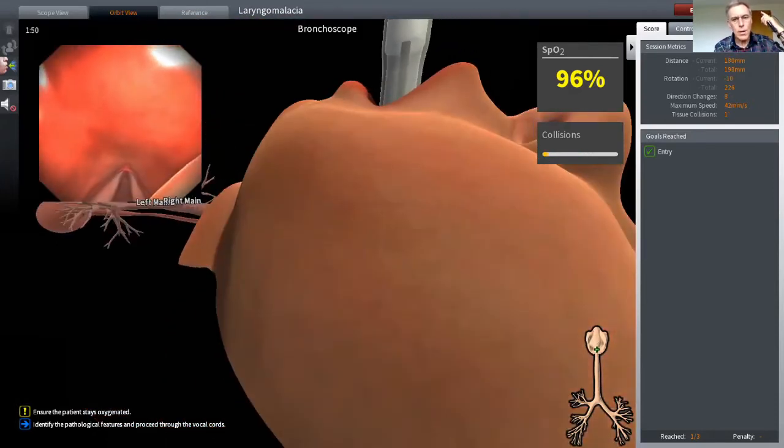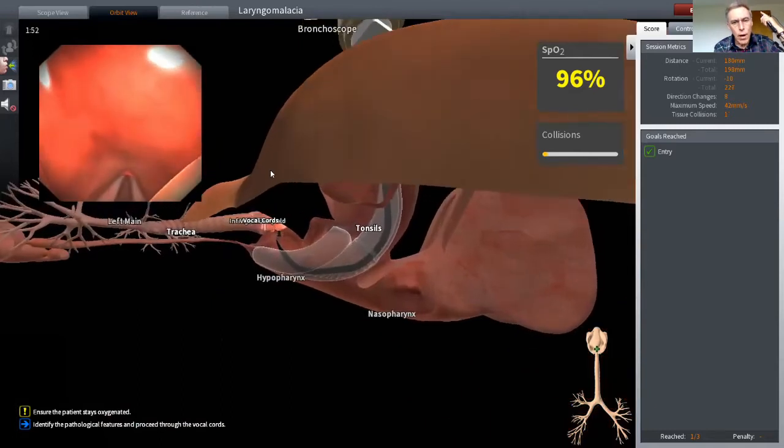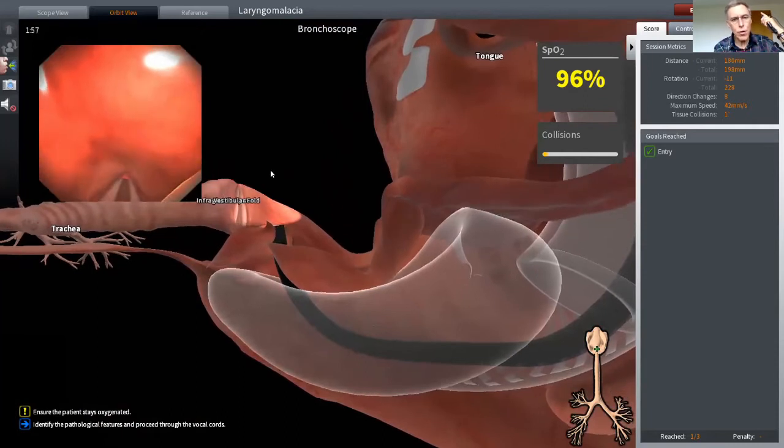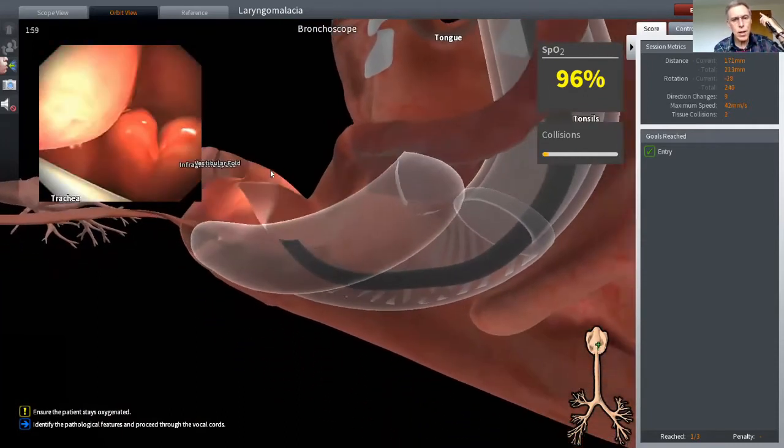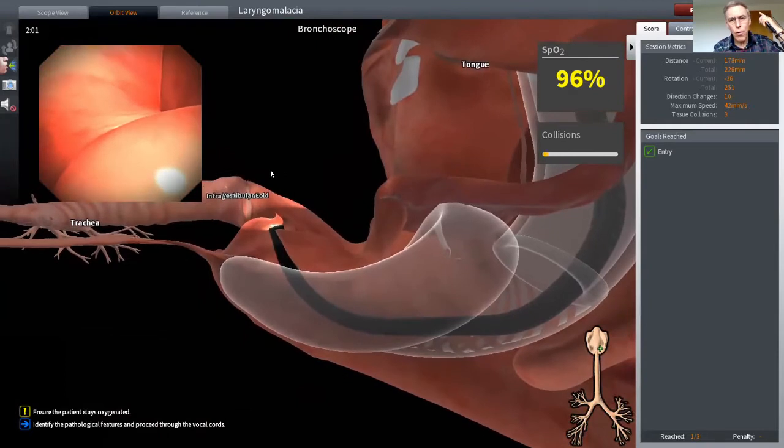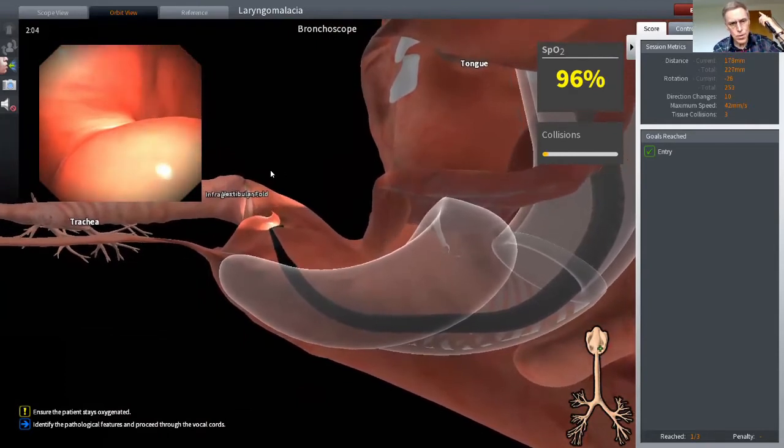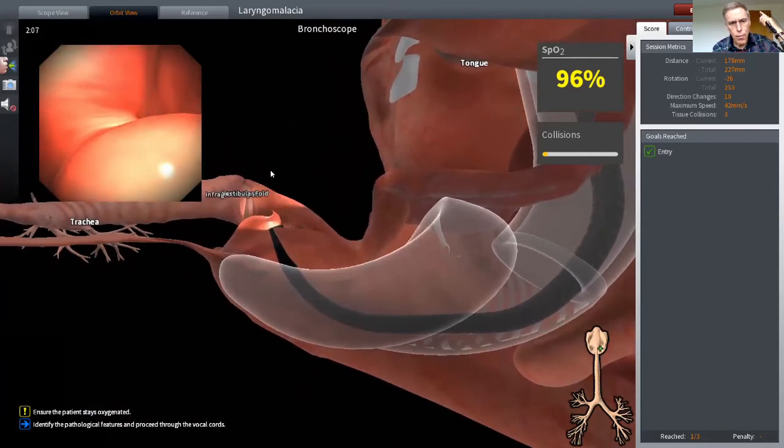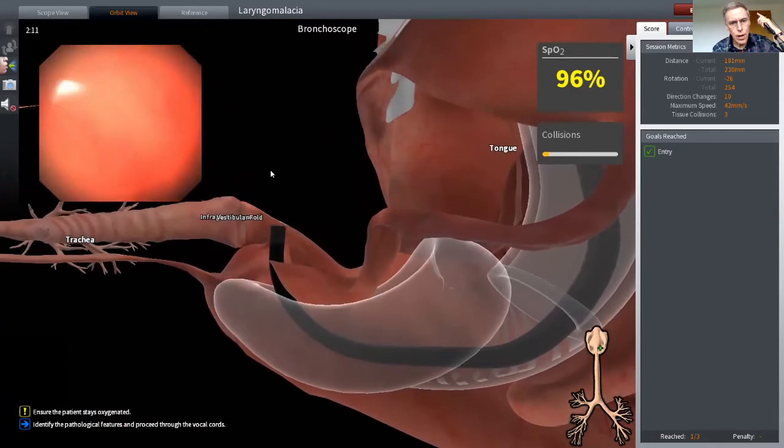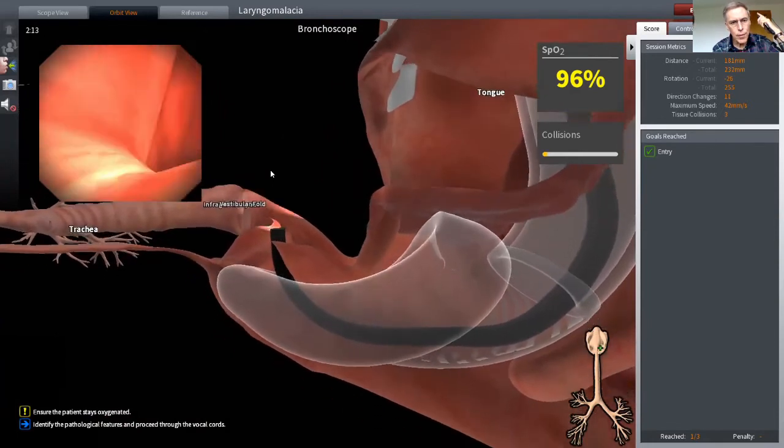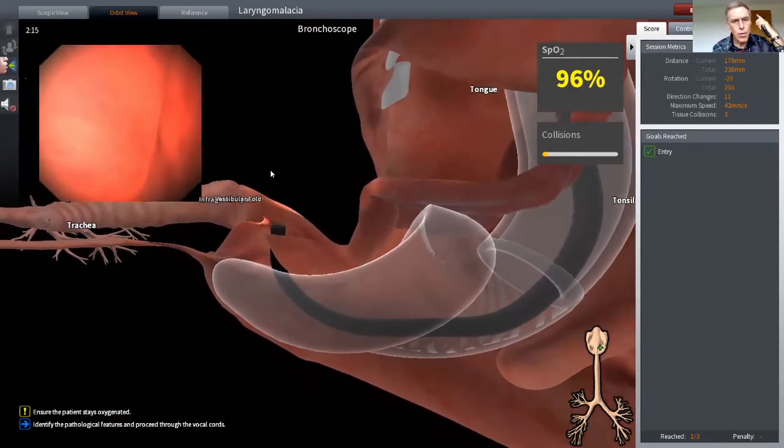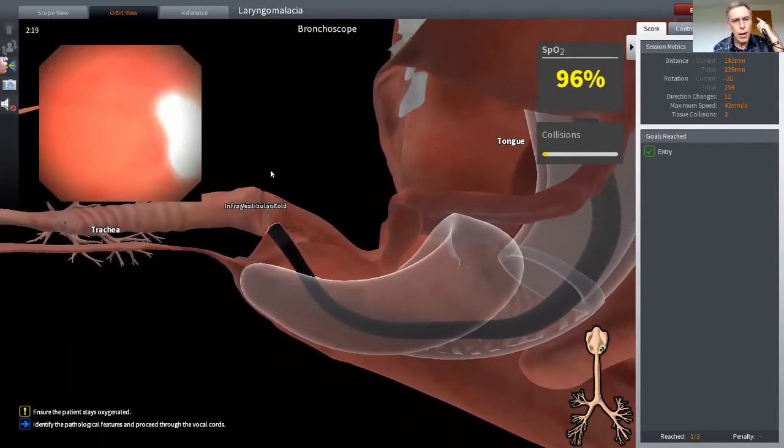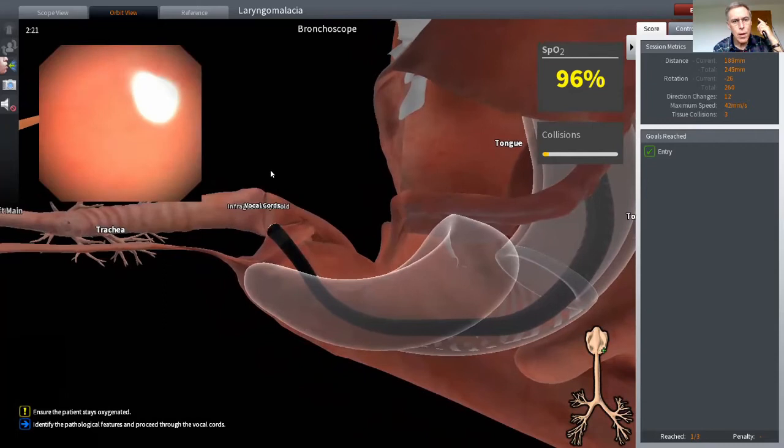Now, this is a fantastic way of teaching and learning airway anatomy, because you get this lovely lateral view, and it's in real time. So you can see my bronchoscope, and already you can see the path that the bronchoscope has taken. It's in a curved upward directing curve, and if I kept on pushing, I'm going to hit on the anterior wall of the airway. So when I direct my tip at this point, I want to push my lever up, and that straightens out the tip.